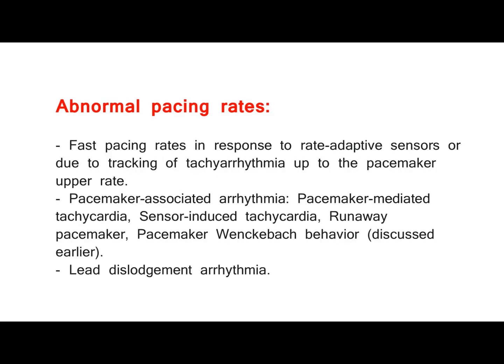Abnormal pacing rates. Fast pacing rates can occur in response to rate adaptive sensors or due to tracking of tachyarrhythmia up to the pacemaker upper rate. Pacemaker-associated arrhythmias include pacemaker-mediated tachycardia, sensor-induced tachycardia, runaway pacemaker, pacemaker-Wenckebach behavior, discussed earlier, and lead dislodgement arrhythmia.